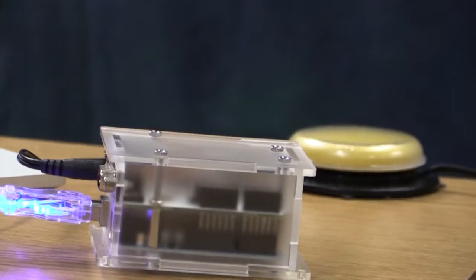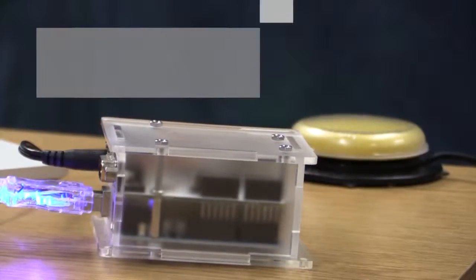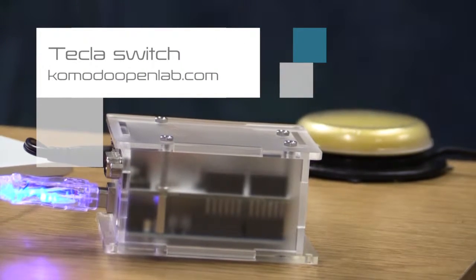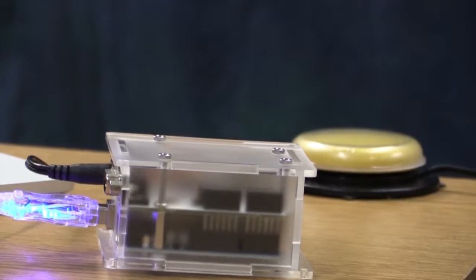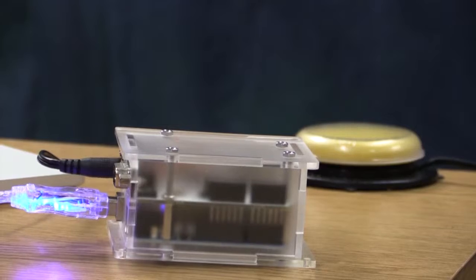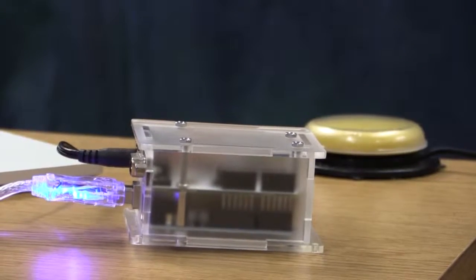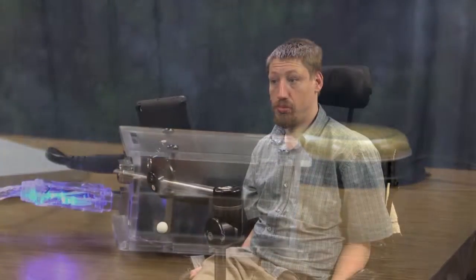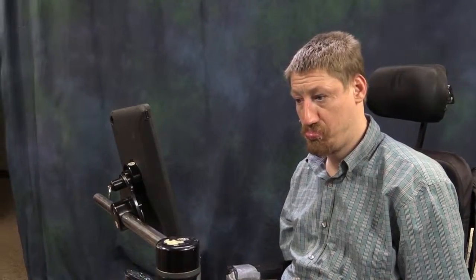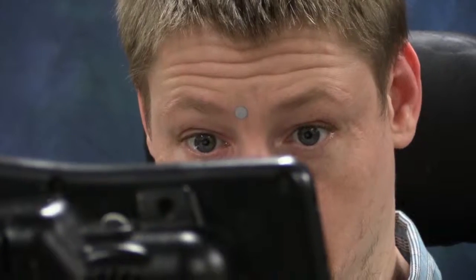In this review I'm using the first generation of the Tecla Shield. There's one really big drawback with this generation of Tecla: it requires an external power source. That source can be an AC adapter or a USB port, thus making it not very portable. If a person had a laptop, you could power it through that, but not everyone has access to a wide variety of technology, especially people with disabilities.